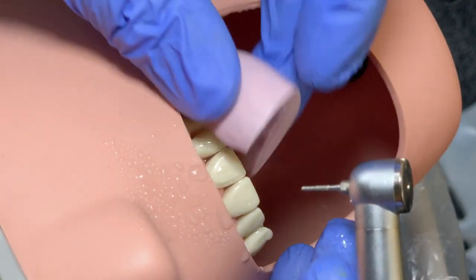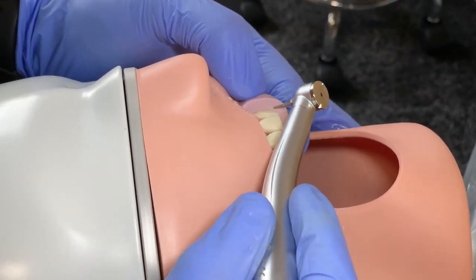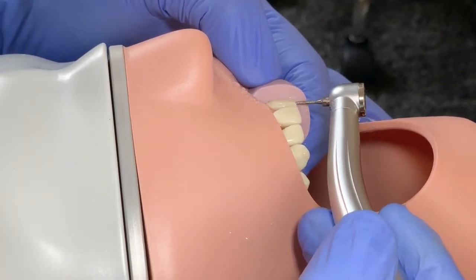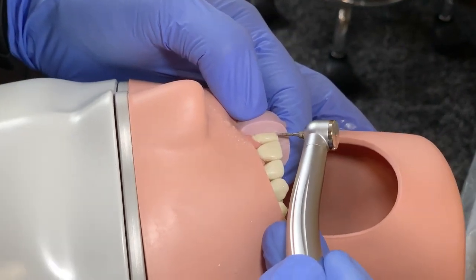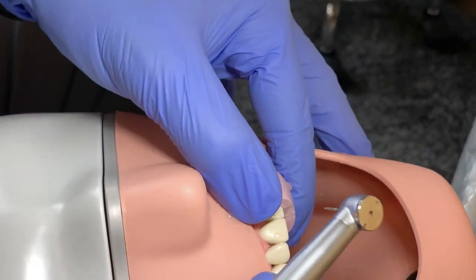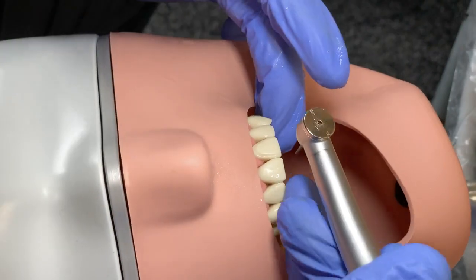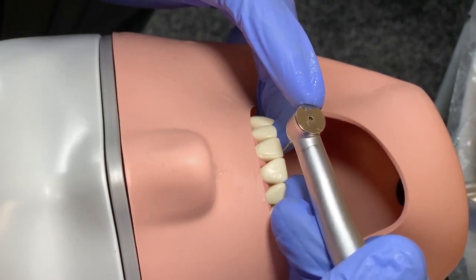Now I'm going to put my index. I put my putty index, and always remember that we need to cut from the buccal surface 0.5 to 0.7 mm, and from the incisal about 1.5 mm. Some prefer to cut the incisal first, then do the outline — it is up to you whether you want to start with the incisal reduction then go to the other surfaces. Make sure that you cut around 1 mm, then leave 0.5 mm to the finishing.